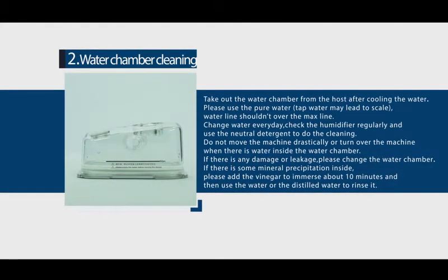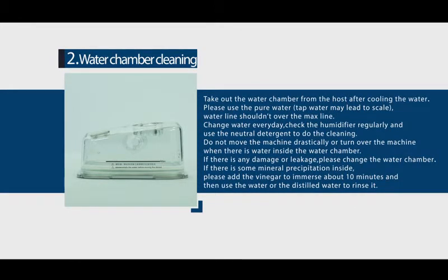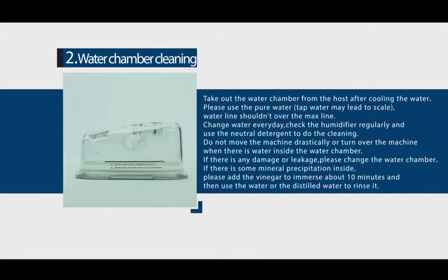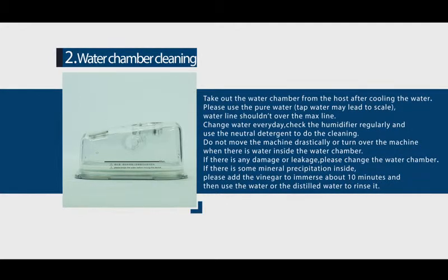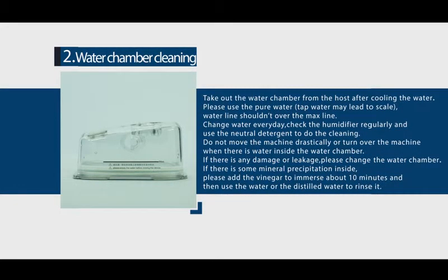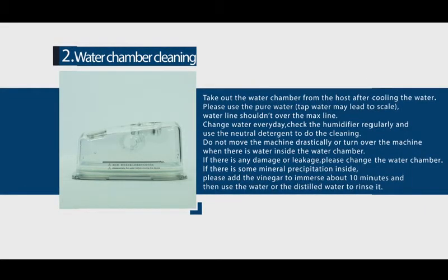Water chamber cleaning: take out the water chamber from the host after the water has cooled. Please use pure water — tap water may cause scale. The water line should not exceed the maximum line. Change water every day and check the humidifier regularly, using neutral detergent for cleaning. Do not move or turn over the machine drastically when there is water in the chamber. If there is mineral precipitation inside, add vinegar and soak for about 10 minutes, then rinse with clean or distilled water.